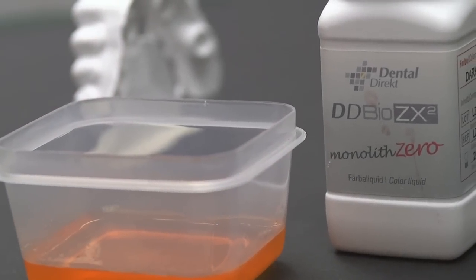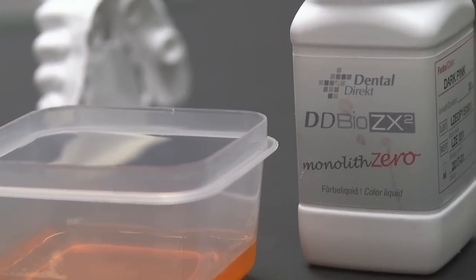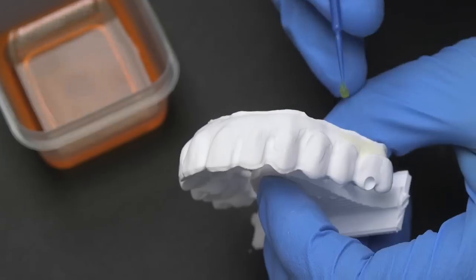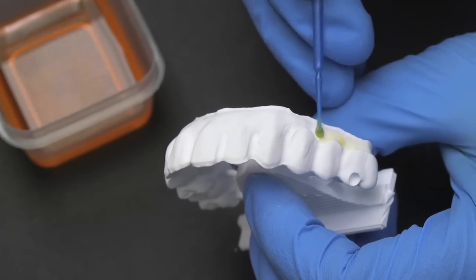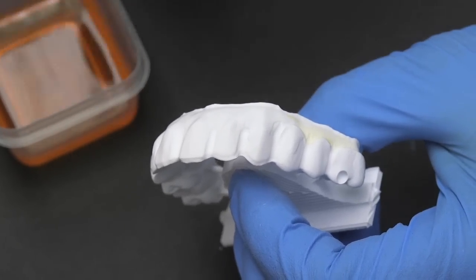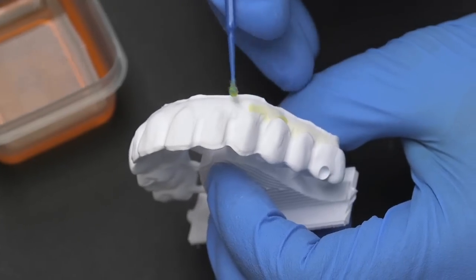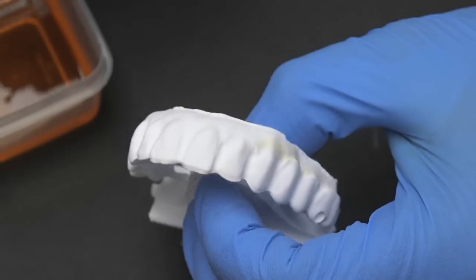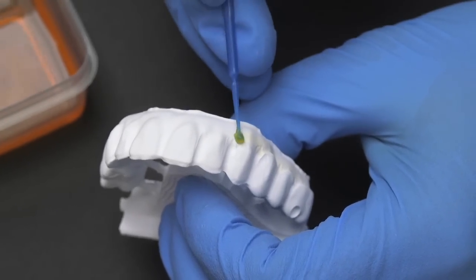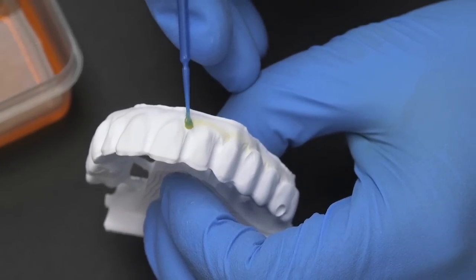Dental Direct also manufactures a tissue shade for full contour hybrid zirconia bridges. This liquid is applied to the tissue area of the bridge using a micro brush. We recommend a total of three applications for optimal absorption of the liquid.